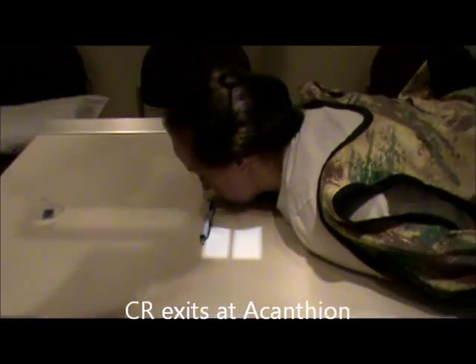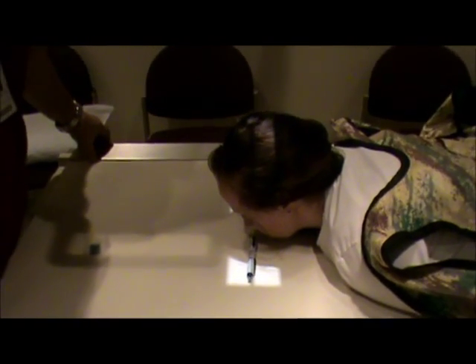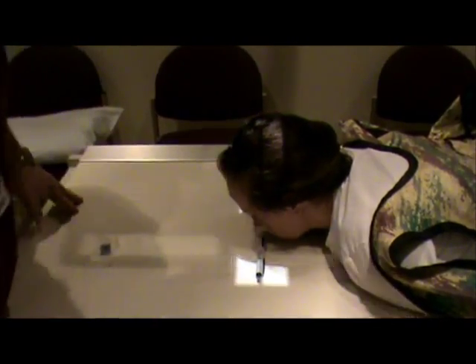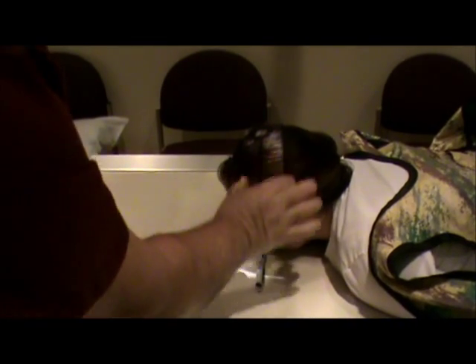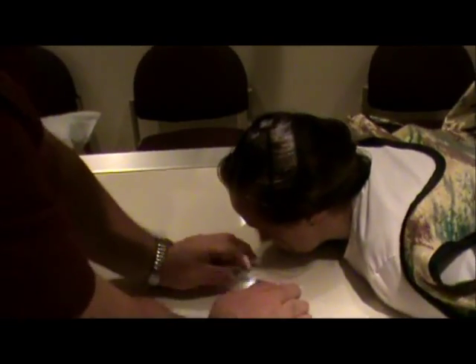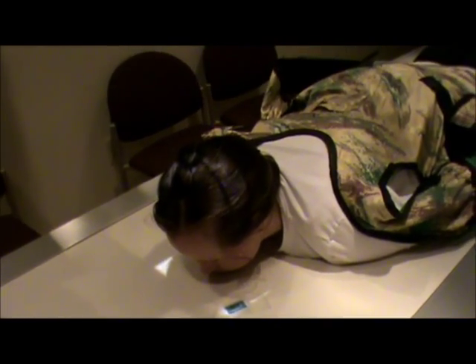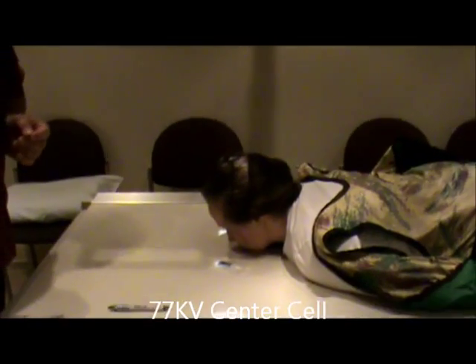Turn the collimation back on and move the tube right on my pin, making sure I'm at the MSP. Collimation is going to be to the skin margins, and it's going to be tight up and down just to the orbits. I've got room here for my marker. This should put the petrous ridges below the maxillary sinuses. The technique is going to be the same — about 77 kV, center cell. This is our Waters view for orbits.